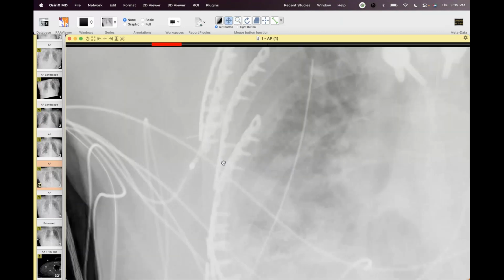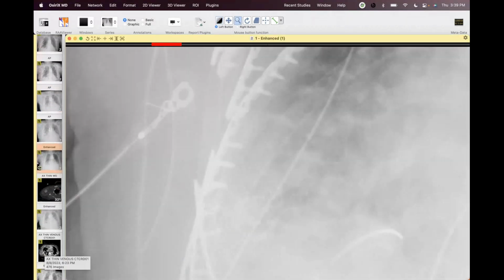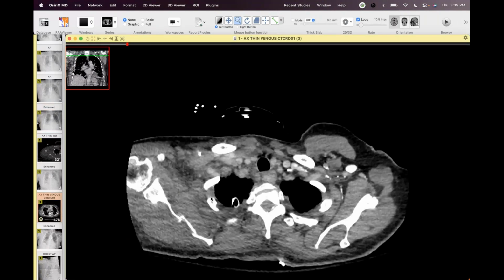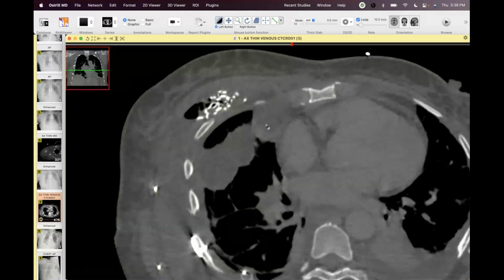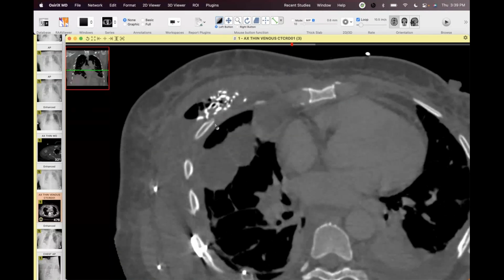And on this one, a couple days later, you can see now that the ribs have moved out of the way, it's there. On this radiograph, it's still there. And it's only over the course of a couple days that the possibility of this being some sort of retained object was raised, and the surgeon actually suspected what this was. Got a CT, and you'll see that it's just kind of wadded up in the pectoralis muscle and anterior to the ribs here. So this is a type of surgical material, and it's nearly invisible.